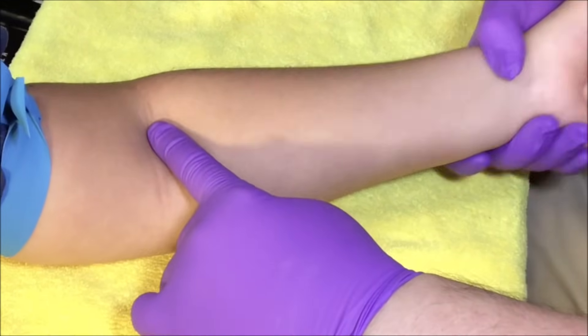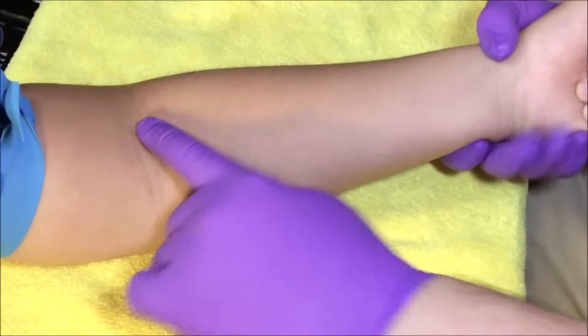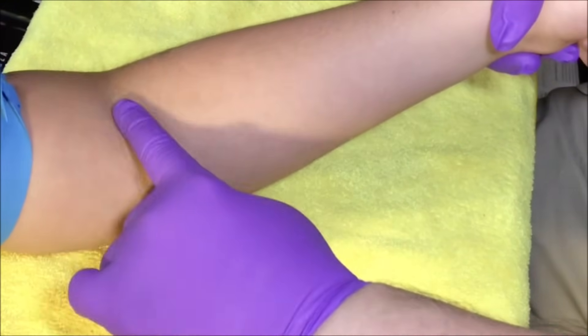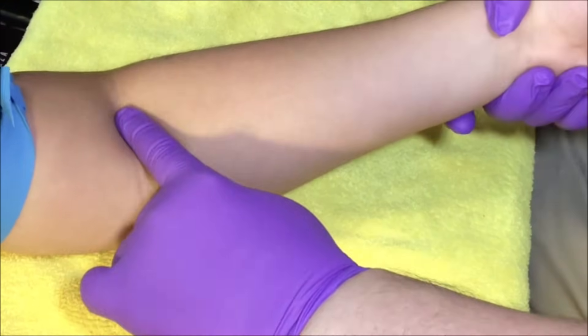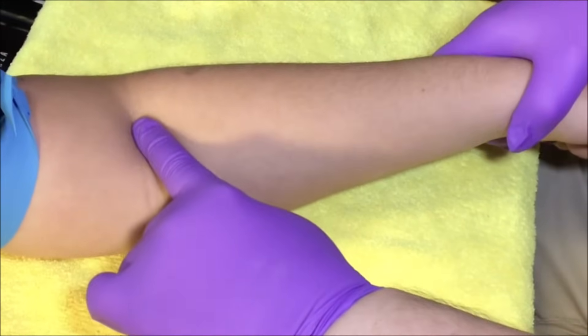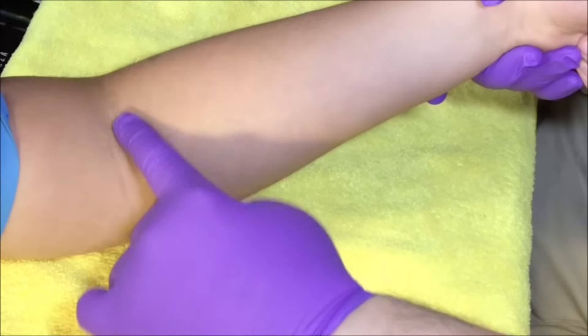If I'm still having a little bit of a difficult time, I'll slightly turn the wrist and pump up a little bit while I'm feeling — just turn the wrist as I'm feeling and locating. A lot of times you'll see that when you're doing this, you can actually feel where the vein is no matter how deep it is.